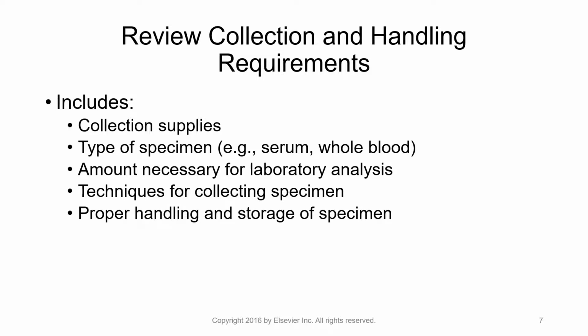Make sure that gets done, and make sure we're doing things like storing the tubes upright when we're asked to. For serum tubes, we have to let them sit upright for a specific amount of time and then centrifuge them. All blood tubes require some version of storage, and it's usually just refrigeration within a certain amount of time, or testing within a certain amount of time. But you have to consider handling and storage after the specimen has been taken.